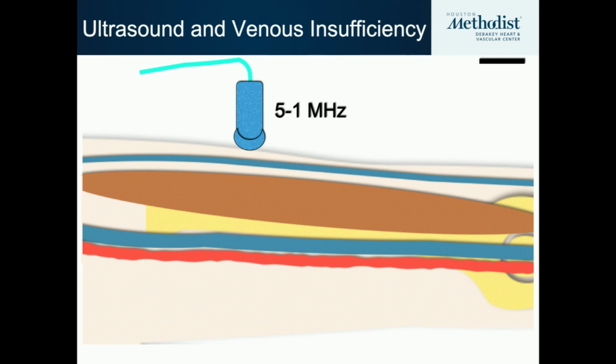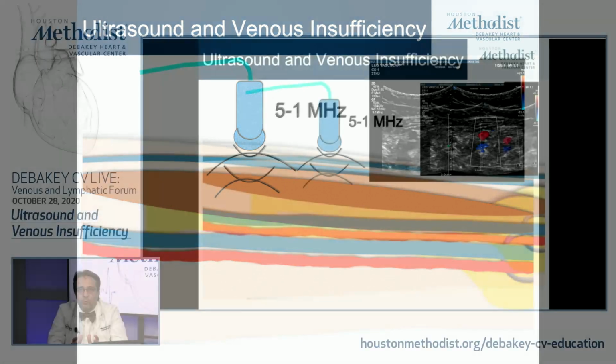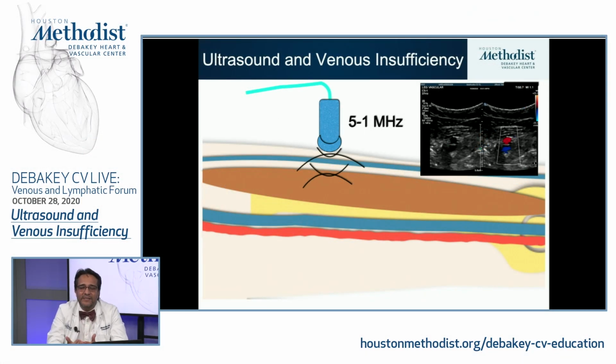Now, if we choose a probe with lower frequency, a lesser amount of waves, what is going to happen is that there is going to be more space between the waves, and it is going to allow us to see deeper with more clarity the images that we are looking for, and we can see this. Now, you notice, maybe you don't, that the depth of this ultrasound is 5 centimeters. The other one was 3 centimeters. I wanted to put two pictures equally, 3 centimeters each, but this probe, in its own design in the machine we have in our office, doesn't let you go below 3 centimeters because the image is going to be of low quality. So the minimum you can go is 5 centimeters and higher.